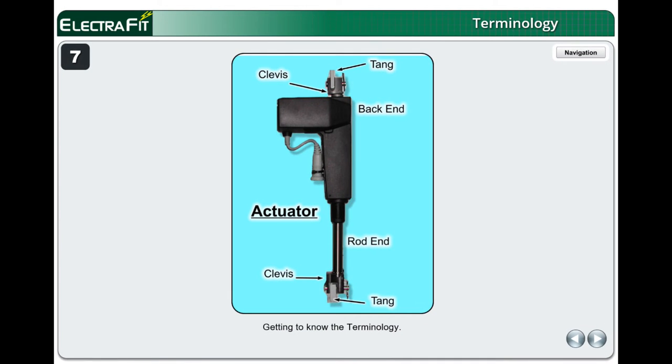Getting to know the terminology: the large end of the actuator is referred to as the back end and the opposite end is referred to as the rod end. The clevis is the forked metal connector at each end of the actuator that fits into a space referred to as the tang. See the actuator label for identification.